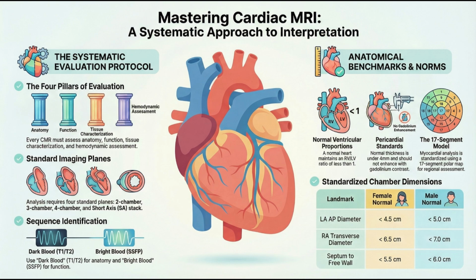It really highlights that in MRI, we aren't just taking photographs. We are querying the tissue. We're asking the protons in the body to tell us their speed, their location, their chemical environment. And if you ask the question in the right way, using the right sequence, they give you an answer that can save a life. It's math disguised as photography. That's probably the best description I've ever heard.